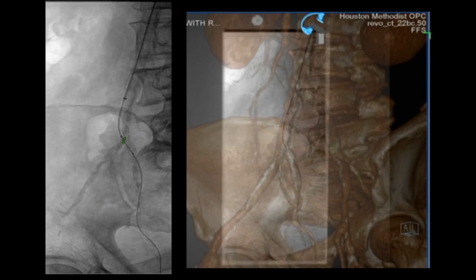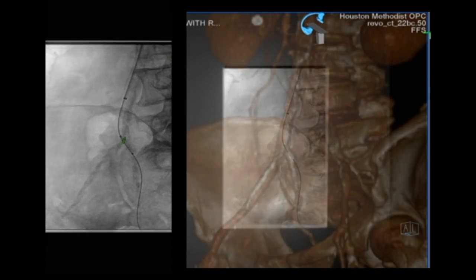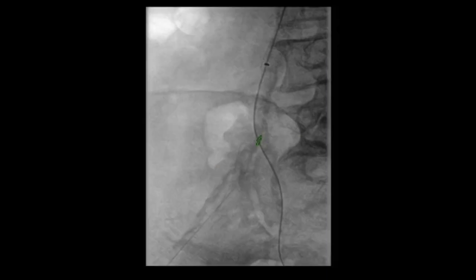The vessel is sufficiently calcified that it actually ruptures the balloon when we tried to dilate it. You can see the rupture and some air escaping from that balloon. At that point we changed the wire out and now we have a stiff wire down there.